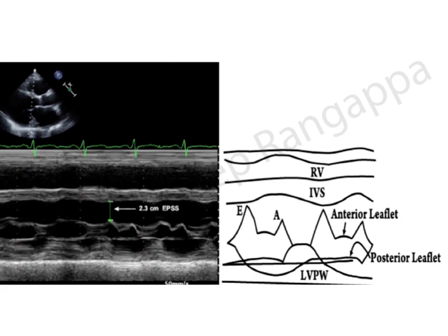Those numbers will correlate to the ejection fraction of the patient. The simple thing to remember is, if the excursion of the mitral valve is very good and approximating the interventricular septum, then your LV function is very good. If it is not approximating the interventricular septum, then your LV is probably dilated and LV function is poor. That is the rough understanding of E point septal separation. Here you would see that the mitral valve is approximating very well, so your LV function is very good. Here it is not approximating.